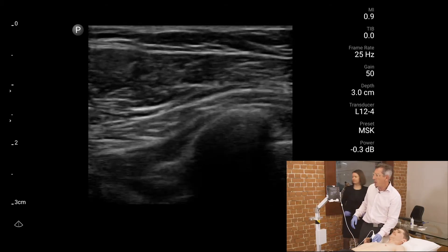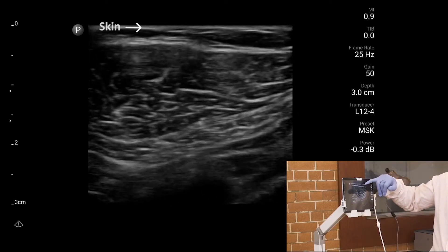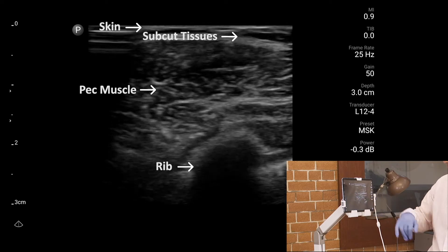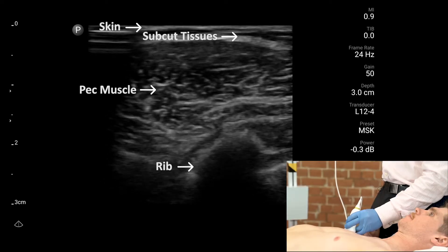What you can see here for the injection is skin, superficial subcutaneous tissue, and a large muscle here — the pec muscle. That shape in the bottom right of the screen is a rib.